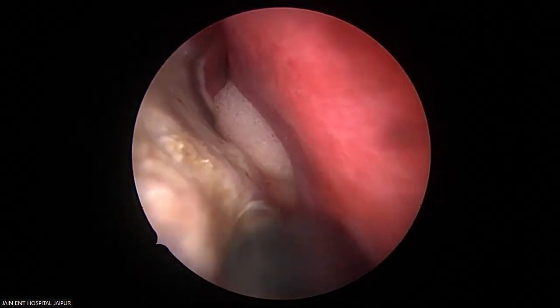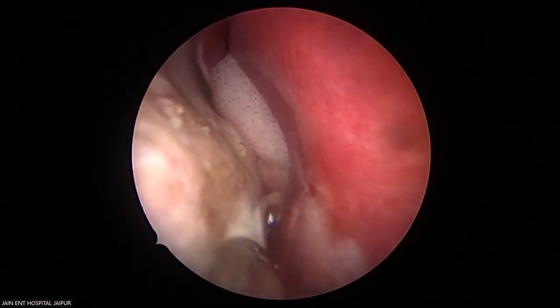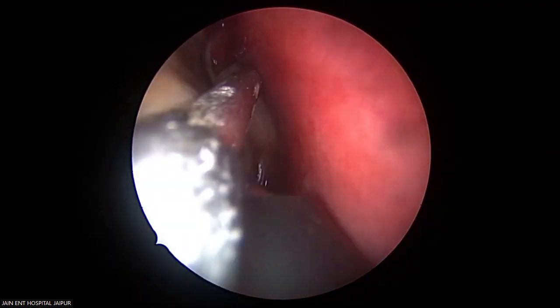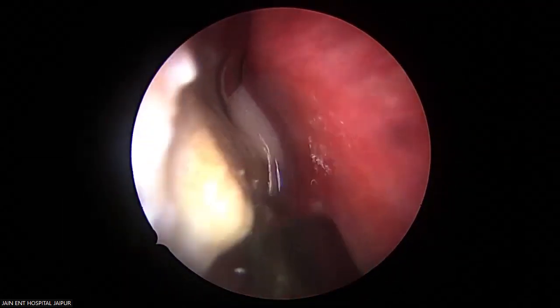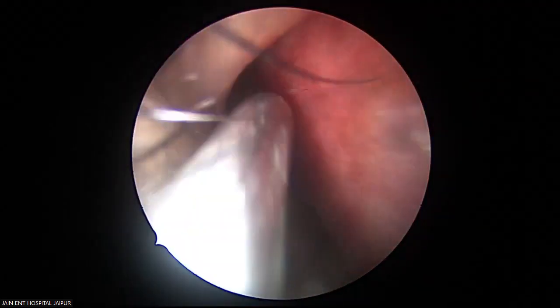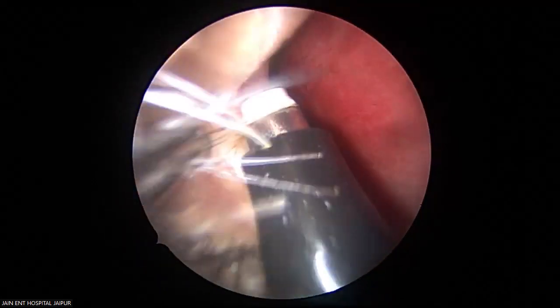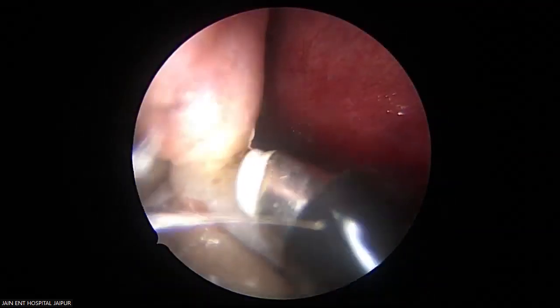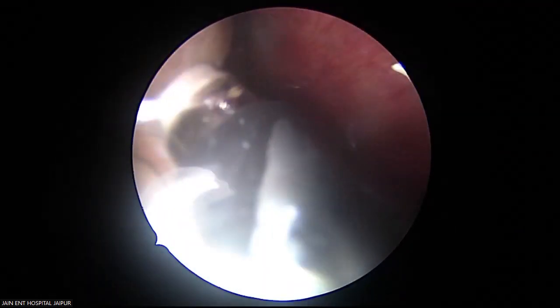See this periosteum, which is otherwise richly vascularized. We have to keep the field better and better. See, this is my anterior limit. Now, for the audience, what is this here? Anteriorly, this is your lower alar cartilage. So never come too anterior to the cartilage, to avoid a deformity.